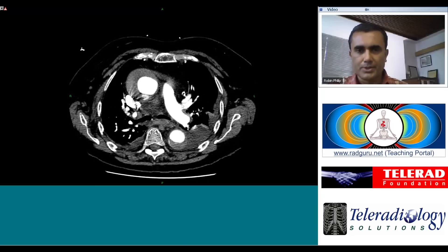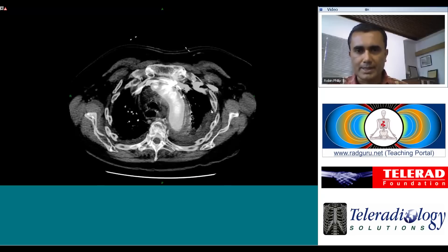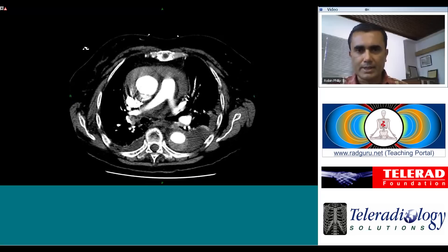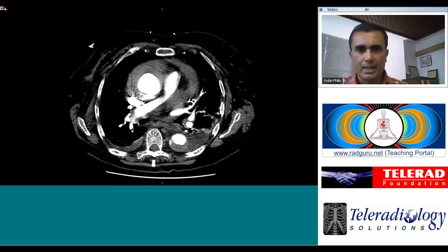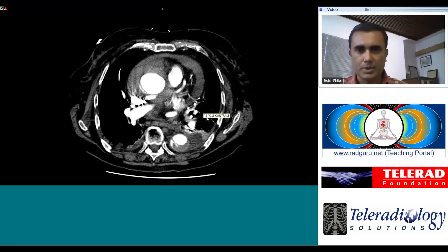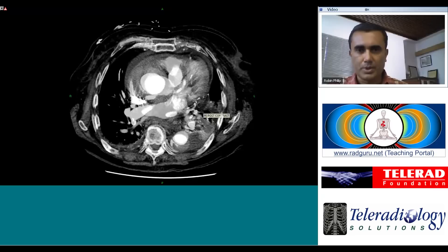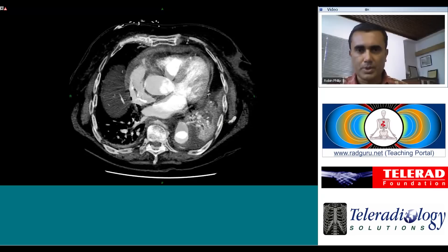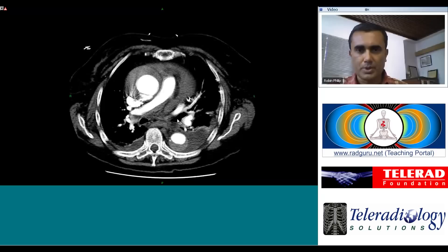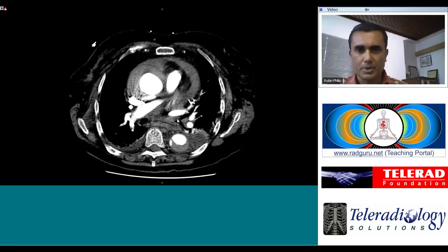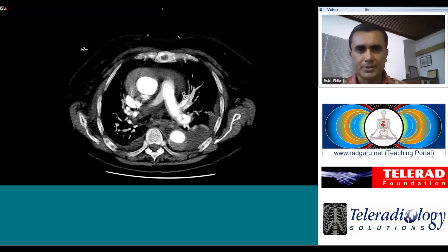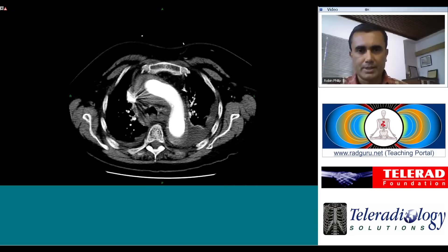This is a patient with an aortic dissection. In aortic dissection we need to determine a few things — one is what type of dissection it is, and we determine that by following the dissection to its origin and its termination.